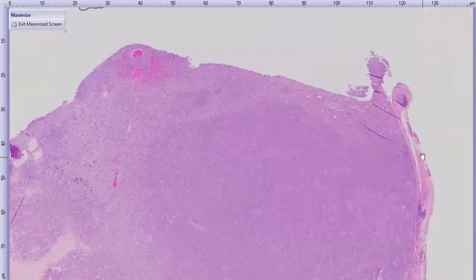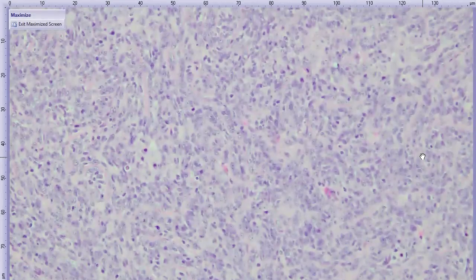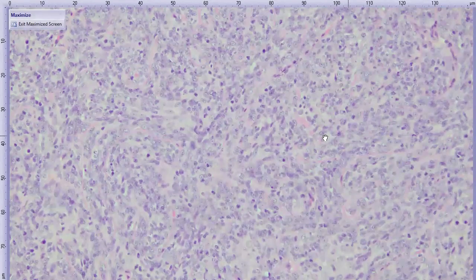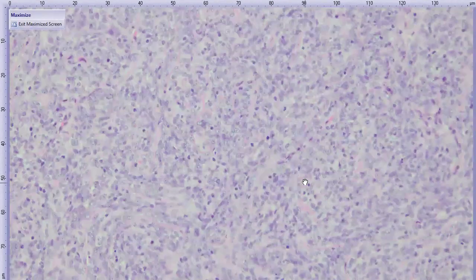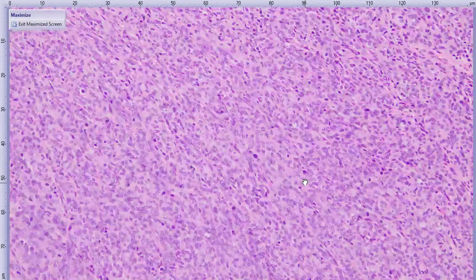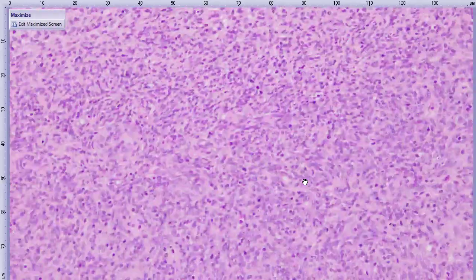So we have this highly cellular periocular neoplasm. If we drop in closer, eventually, there we go. We have some cells that are not really forming great patterns, and oftentimes these cells are looking a little bit more spindle-shaped. But even up here, you may begin to detect some degree of cord or lobule formation. I do think there are better areas for the spindle-shapedness. Maybe over here. The exposure is doing weird things too.